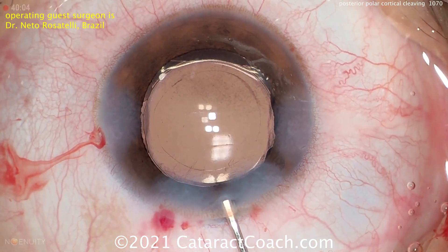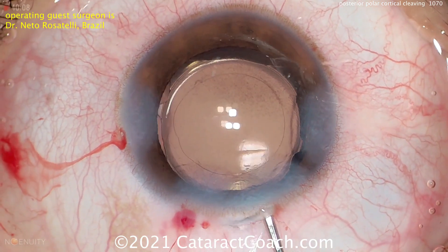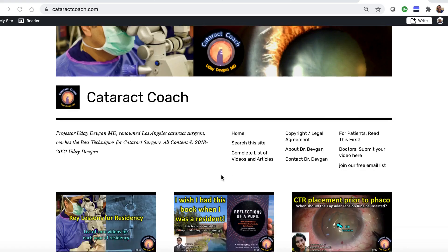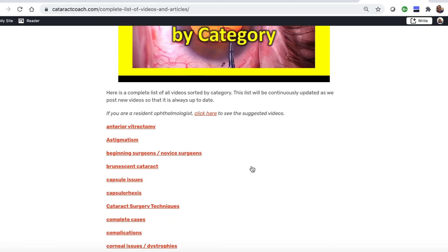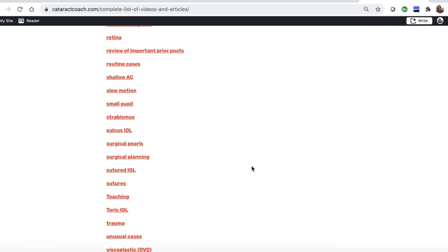Dr. Rosatelli reports that the risk of complications like posterior capsular rupture is much reduced using this technique. Now this does require one important thing — you have to have the dexterity to do it, and not just dexterity with your dominant hand, but also dexterity with your non-dominant hand. Both hands have to have equal dexterity to physically separate, on a mechanical basis, the cataract from the capsular bag.